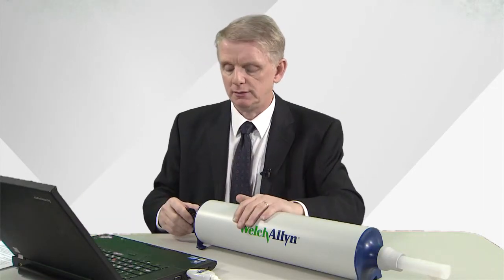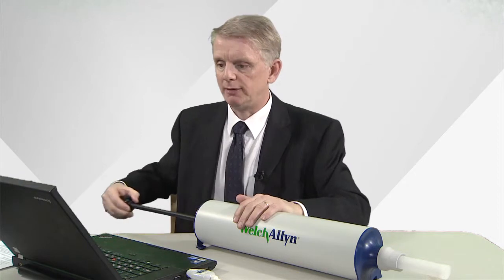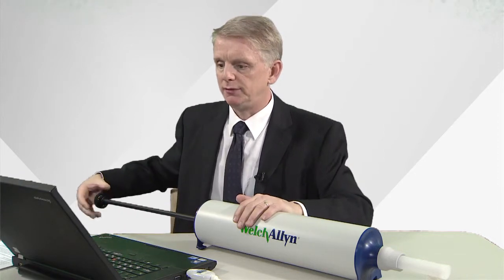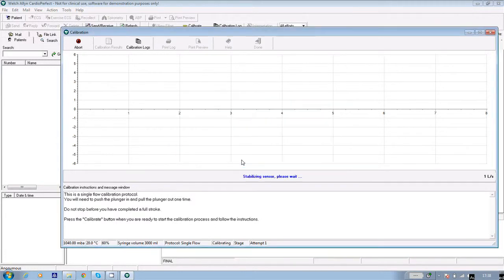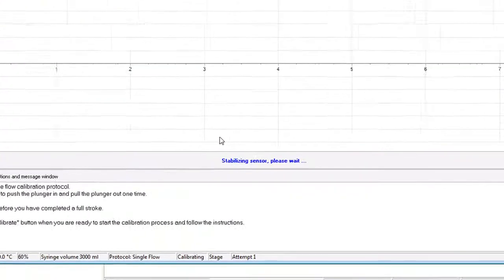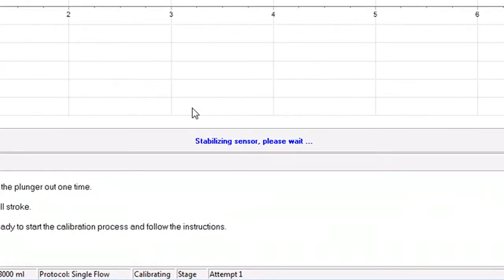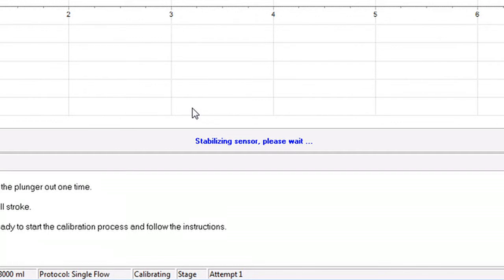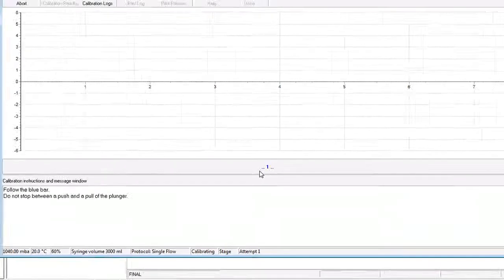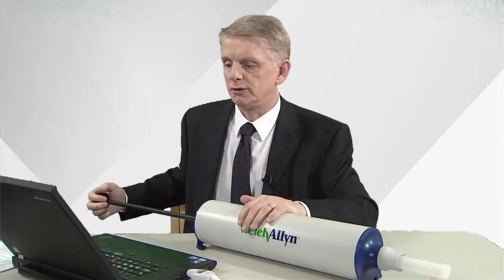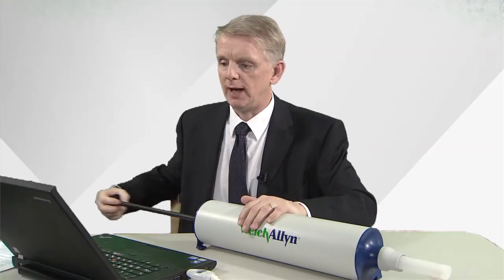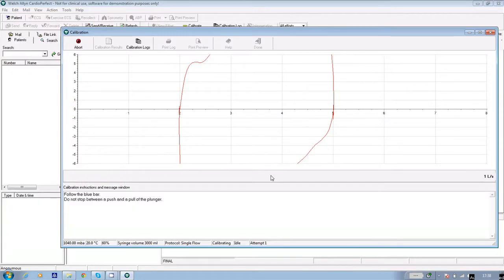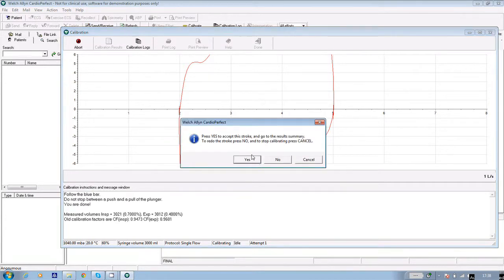If you haven't already done it, pull the plunger out to fill the syringe completely and click OK. Wait until the stabilizing sensor message disappears. The software counts down three, two, one. And when the blue bar goes across, push the plunger in and pull it out one time. Don't stop between them.